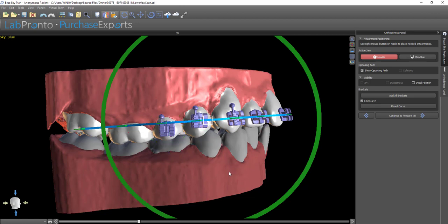In future releases of BlueSkyBio Plan, this process will be automated. But in this current release, this is the technique to align the brackets to the teeth.